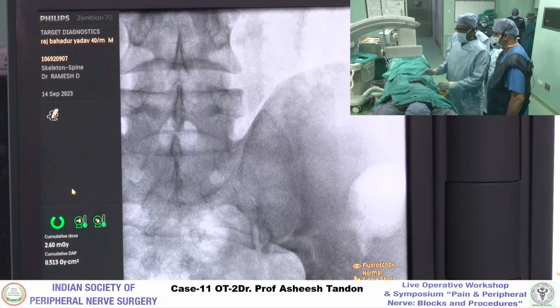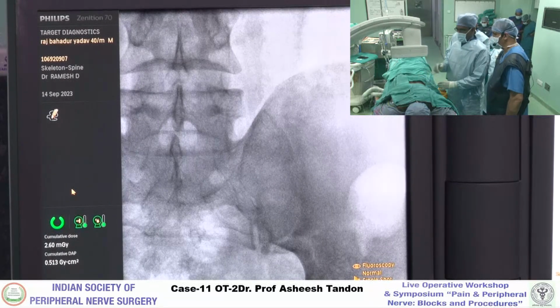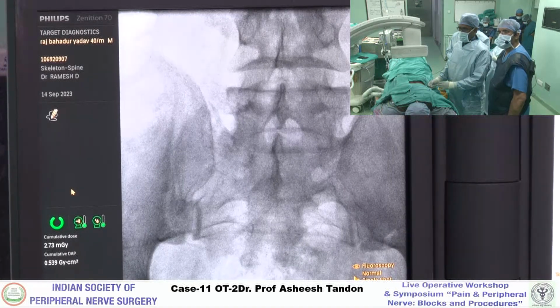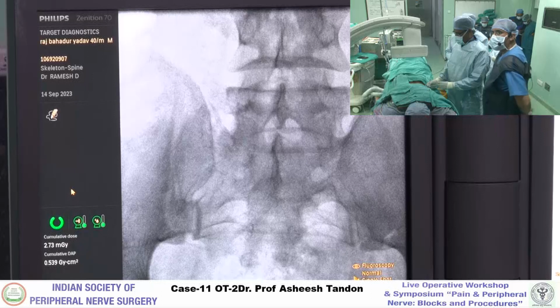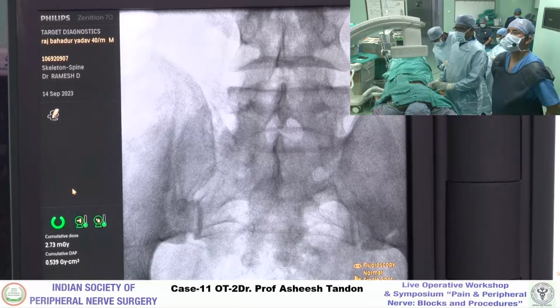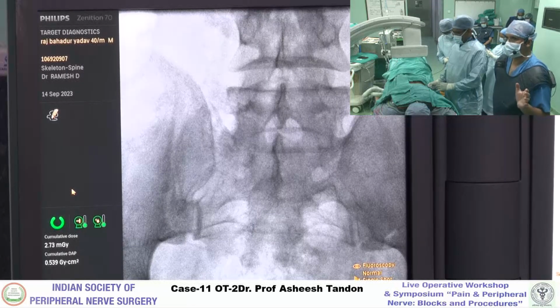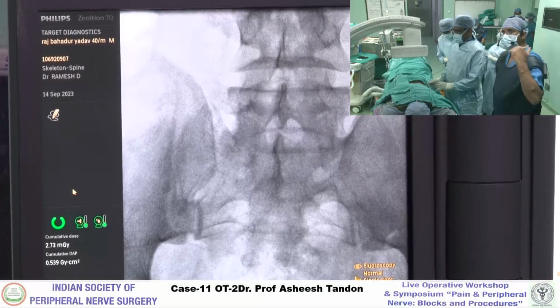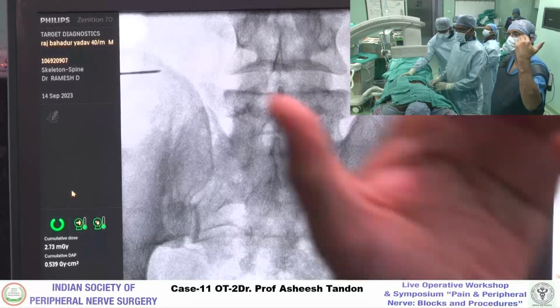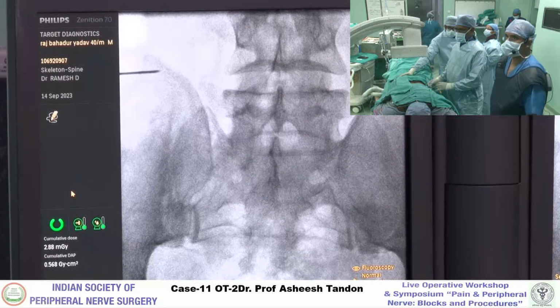Okay, go ahead, yeah, on the left. Shoot please. Go ahead. Now, if you see the audience there, this is typically a high iliac crest. So the iliac crest is not just crossing L5 S1, but it is way beyond L4-5 as well.